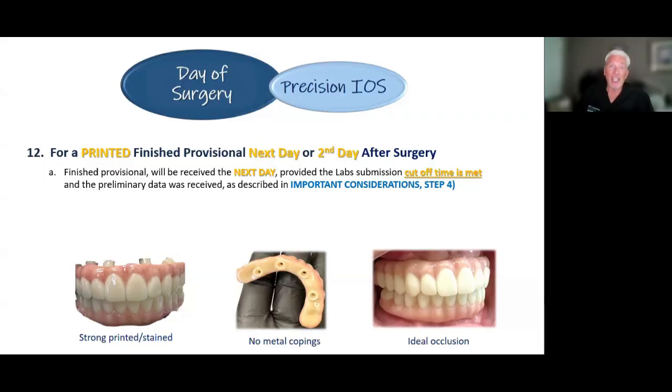And to my oral surgery and my perio friends, this is where we see a really good practice builder when doing these types of cases, where the patient leaves with just healing caps on the MUAs. They're not going to be chewing anything anyway. So 8, 9 o'clock the next morning, or based on where your doctor's located, maybe 10:30 in the morning, the patient shows up at your restorative doctor. All they need to do is unscrew a healing cap and screw in the bridge.